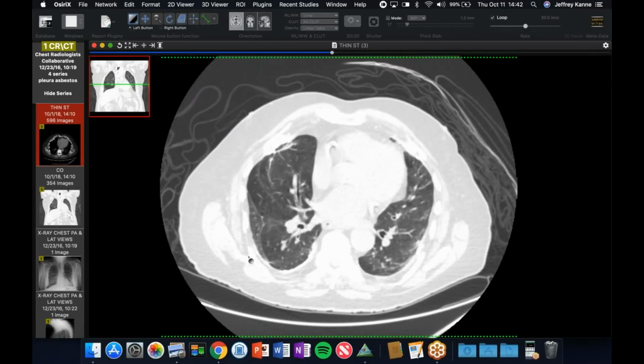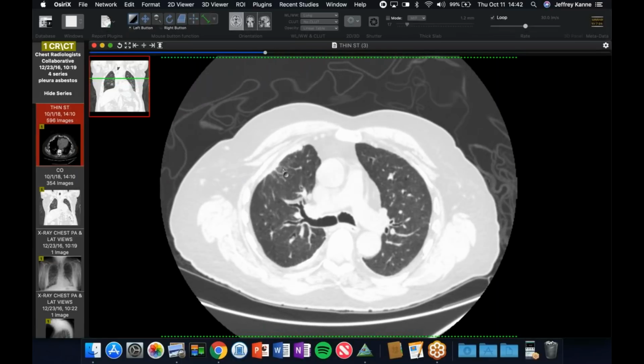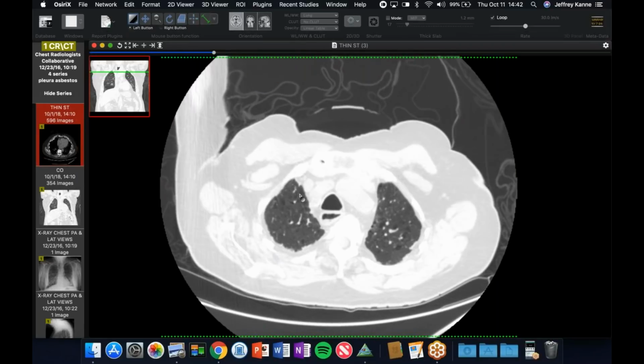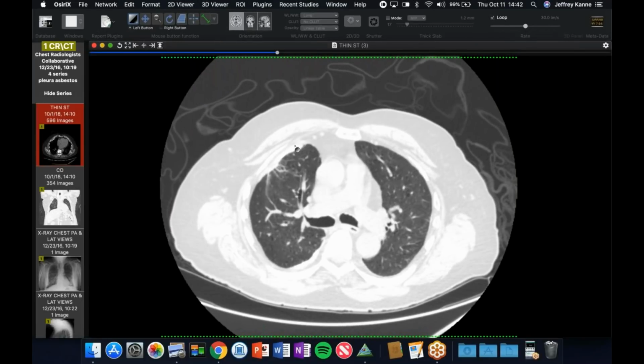Now, why does this not happen, even though we see plenty of plaques? Well, the other observation to make is there's a lot of parenchymal bands and these sort of curvilinear bands adherent to these plaques and these little kind of lines coming out of it. And they've been described in the literature, mostly from Britain, as hairy plaques. And to me, what's happening is most of the time the pleural plaques sit on the parietal surface and leave the visceral pleura alone.